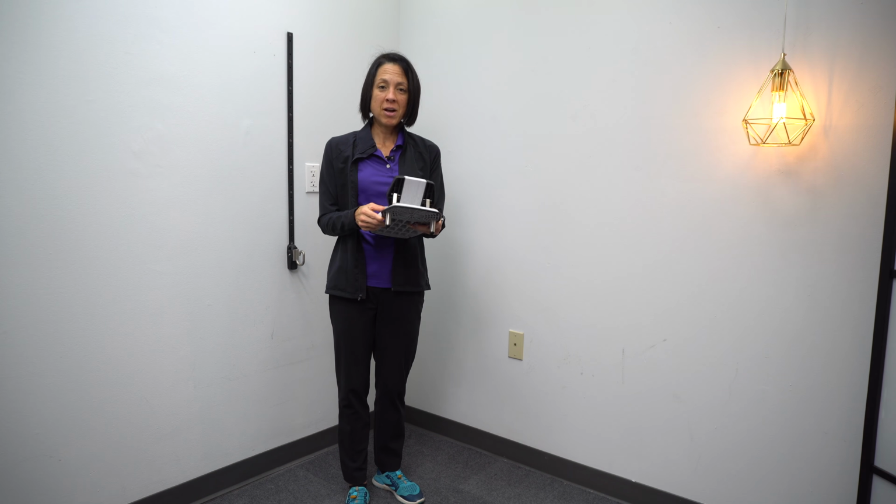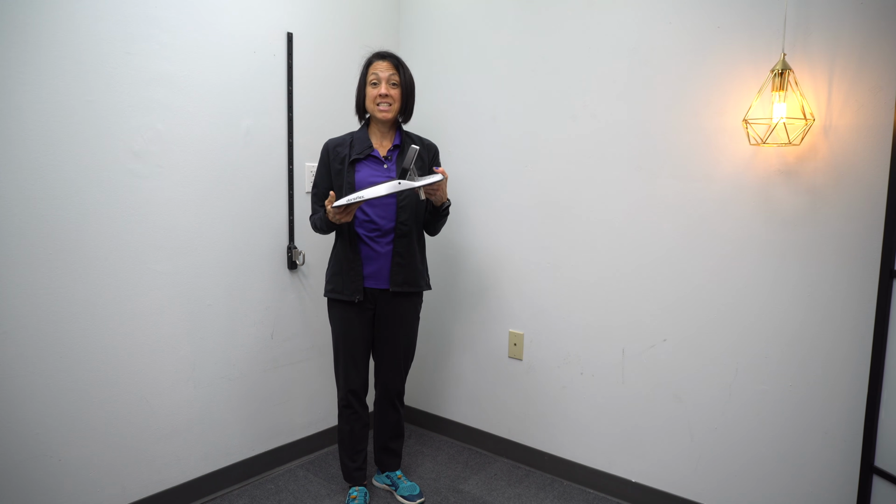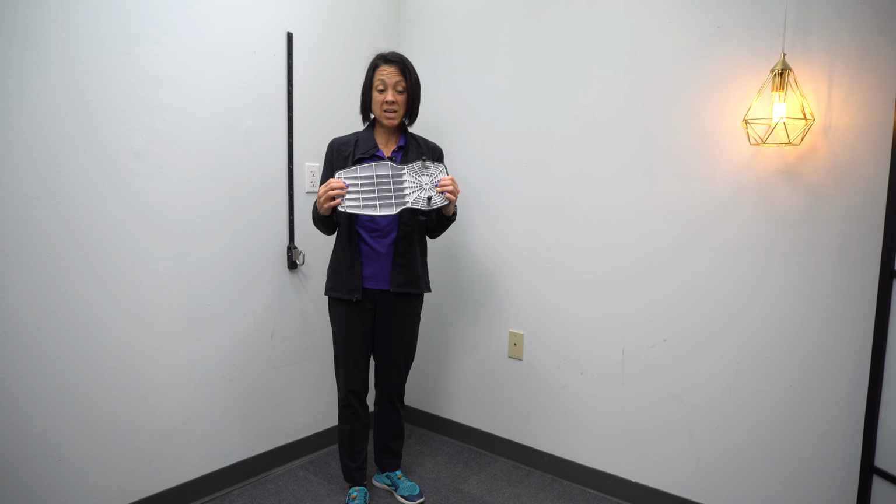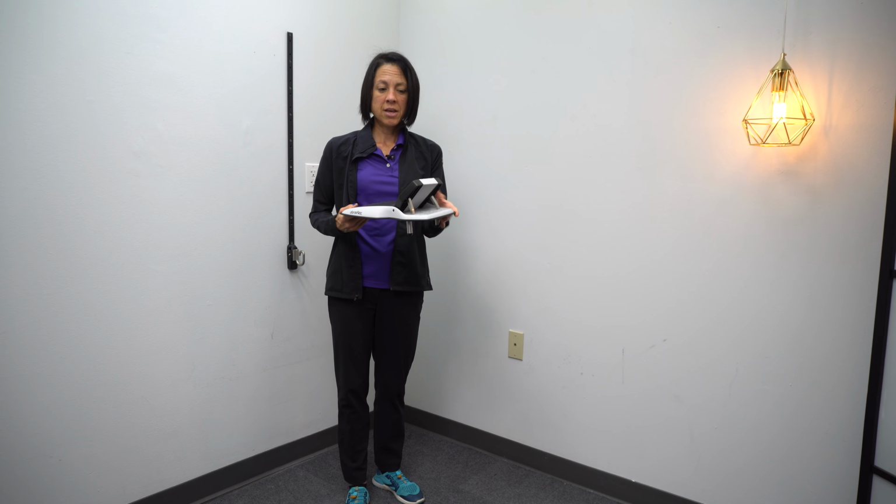Now, what I love about this tool is that it's first heavy. So you don't want something that slides around on the ground, which is a problem with the foam wedge that I've shown and some other things. It's pretty heavy and it's got rubber on the bottom, and so it does stay in place, which is what I love. The other thing that I love is there's two adjustments here. So you can keep one side up and let the other side drop down.